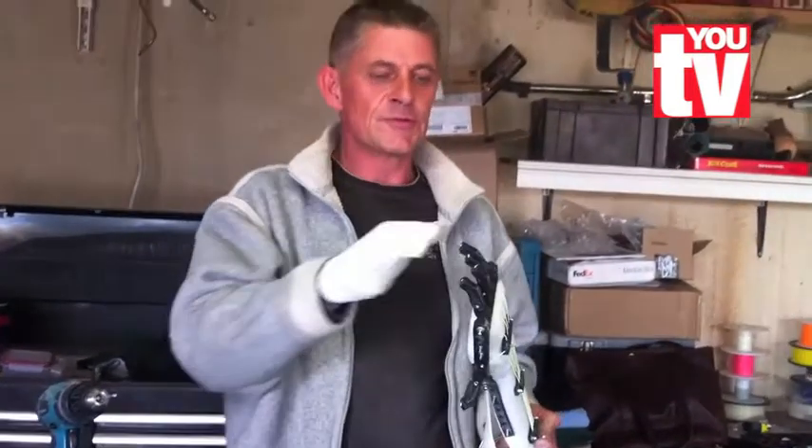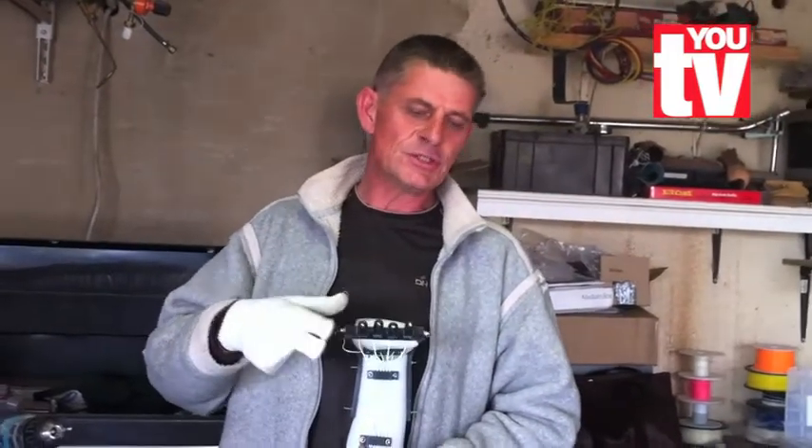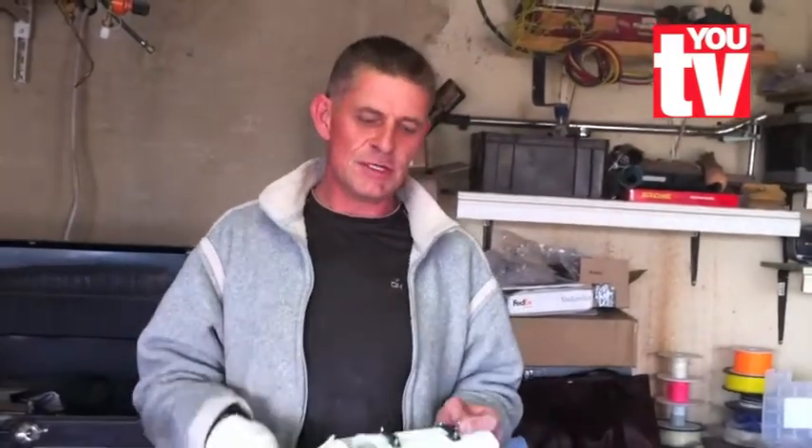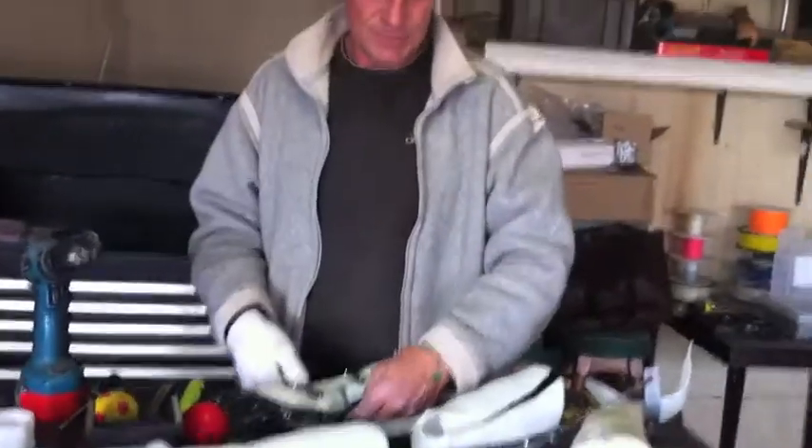The only thing I couldn't do was, with the tendons, was to return it with string - I had to use elastic. But the rest is just as you see a hand, so it's this thing.